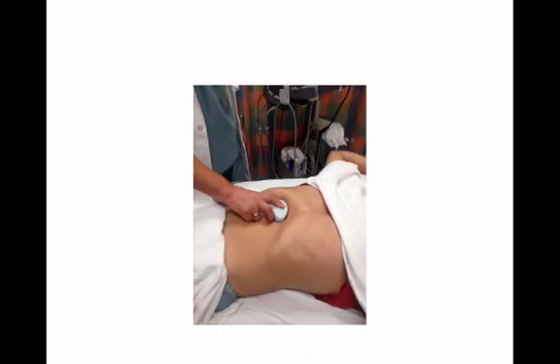Let's move on to the pertinent orientations for this study. All of our patients are in the supine position, as in this picture here. Our aim is to generate a coronal view of the heart using a subxiphoid view or approach.